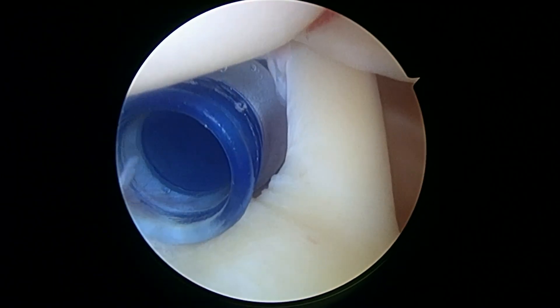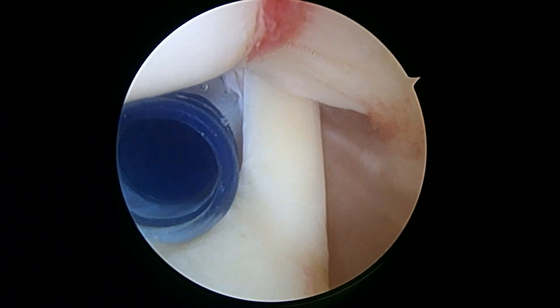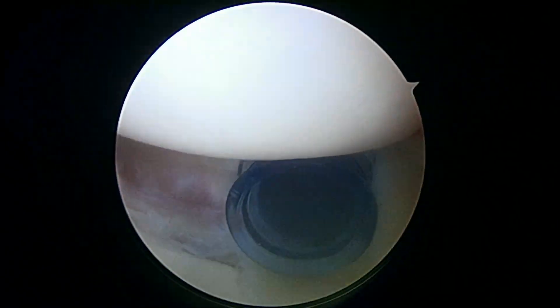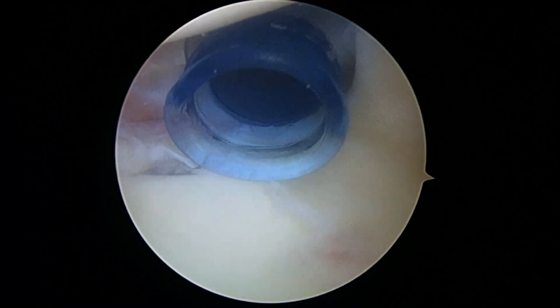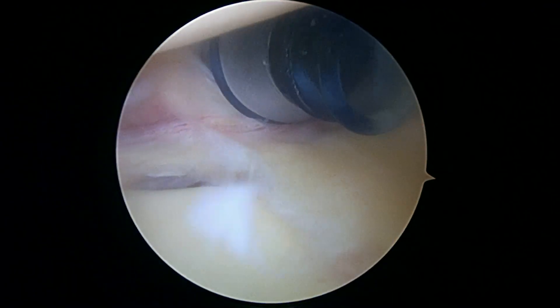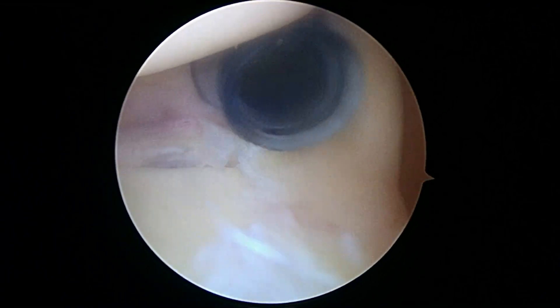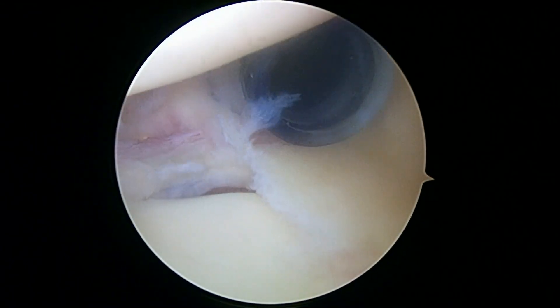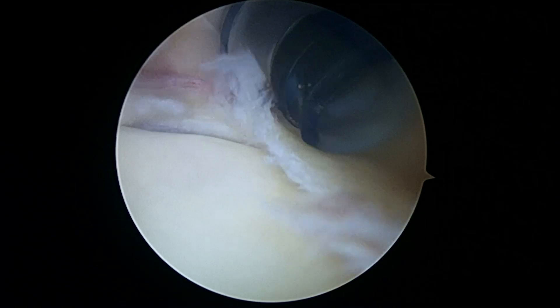Everything you see is magnified 30 or 40 times on the screen. We've got this blue cannula coming in on the left of the biceps tendon. Here's your biceps and here's the tear.